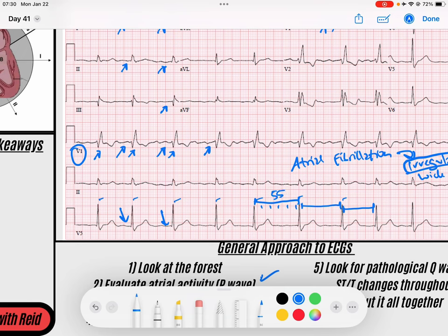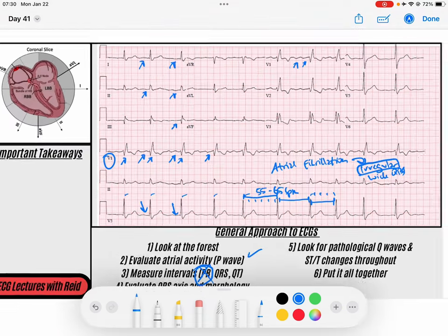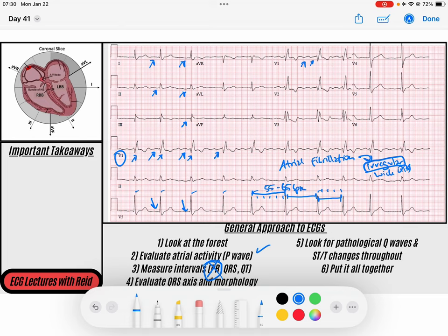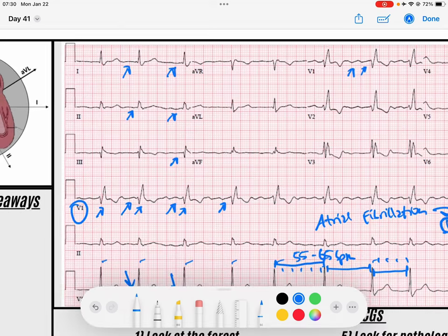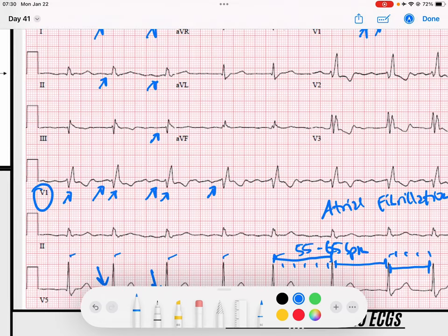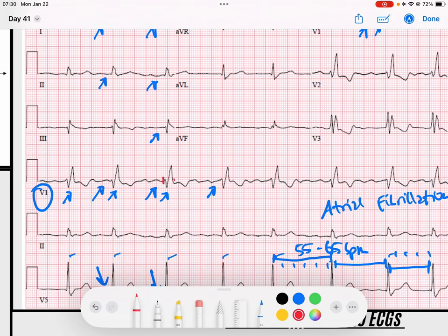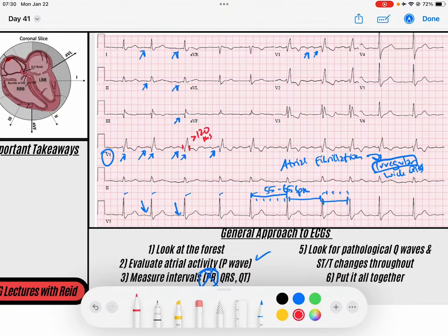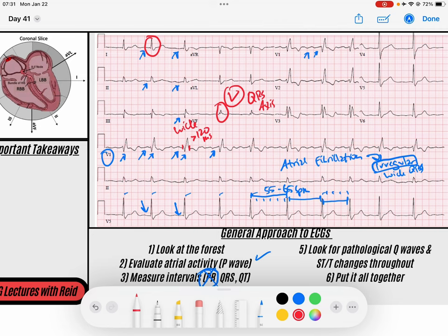Comparing another complex — 300, 150, 100, 75 — maybe 65 beats per minute. So this is about 55 to 65 beats per minute, which is a normal response, a little on the slower side. Now let's look at our QRS complexes. We said they are wide — greater than 120 milliseconds in duration. The QRS axis is normal: upright in lead one, upright in AVF. So we've got a normal QRS axis, but it is a wide complex, and I need to form a differential for what causes a wide complex QRS.